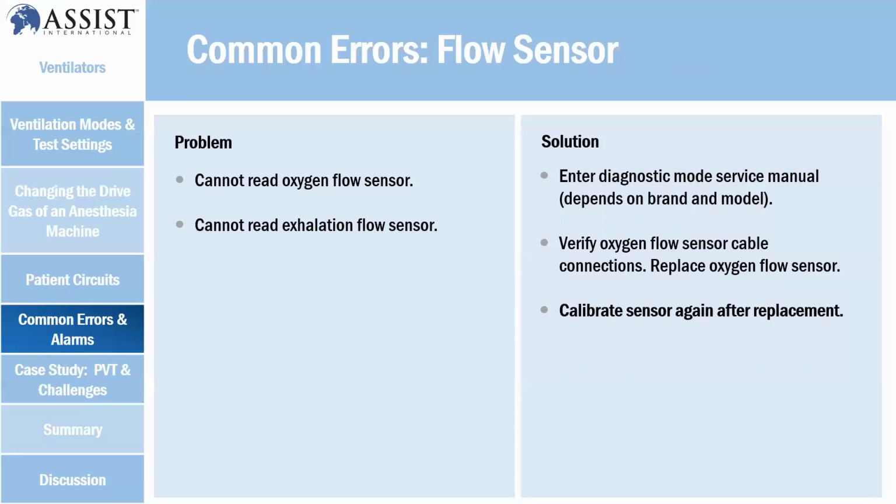Flow sensor is another common error. Cannot read oxygen flow sensor, cannot read exhalation flow sensor. Sometimes you don't get an inspiratory reading. So enter diagnose mode and check, depending on the brand and model, and verify what's going on with the flow. Verify the oxygen flow sensor, the cable connection, replace it, or another important thing is to calibrate them and see whether it's working or not.